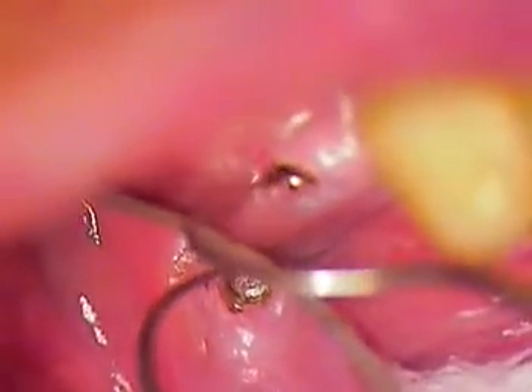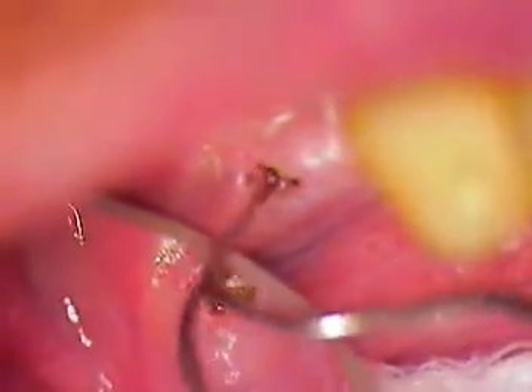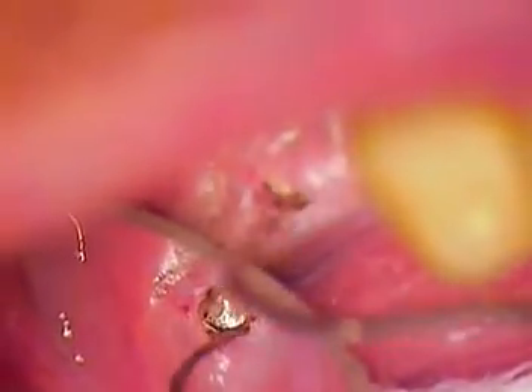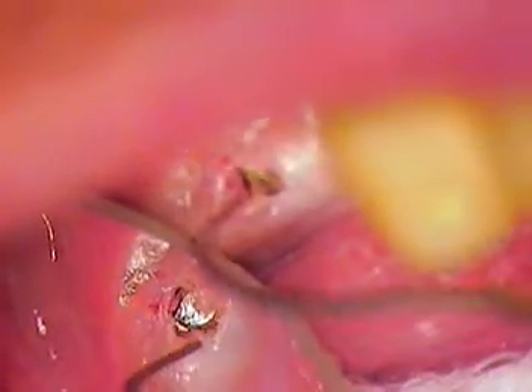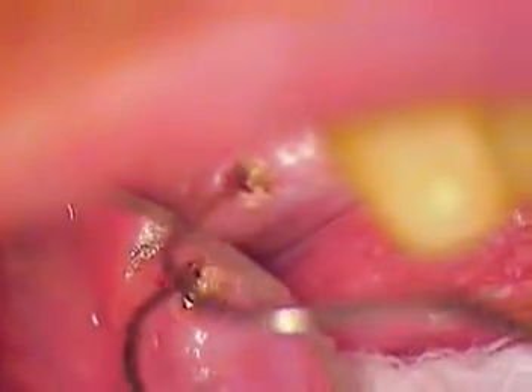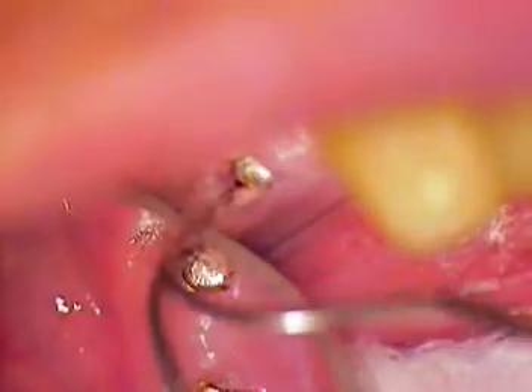I'm using it as a long explorer and I've got the end of it pretty blunt, just to make surface contact. There's a flap of tissue in there — I don't want to slide this piece underneath. Let's just slowly coax this out.